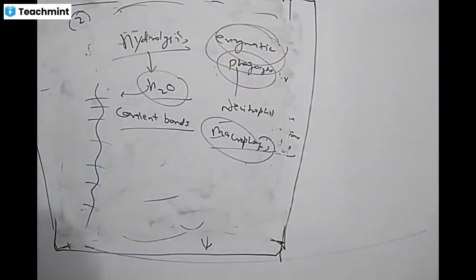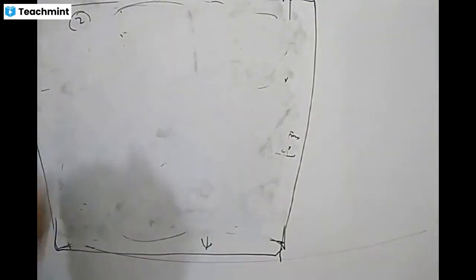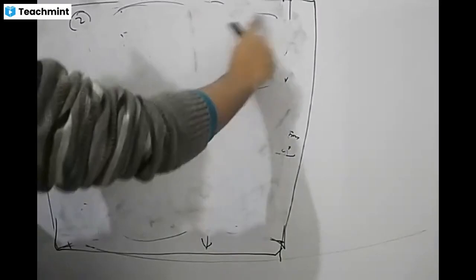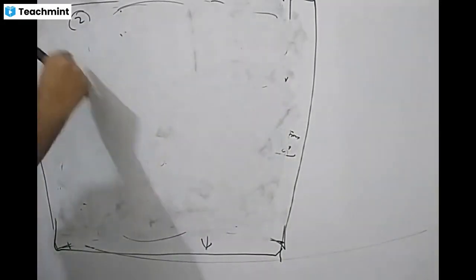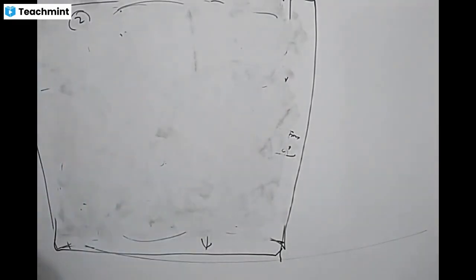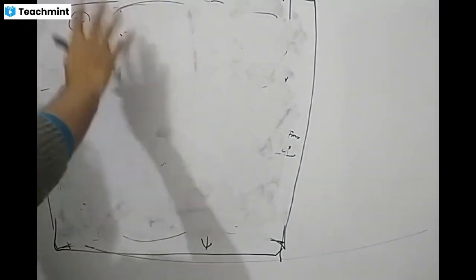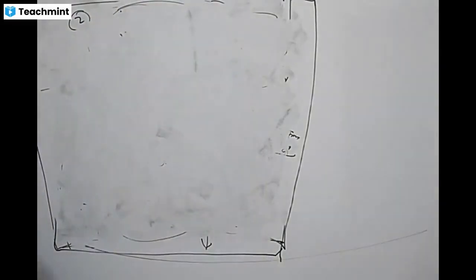So the second characteristic is absorbability. The suture material may be absorbable or non-absorbable. It depends on the place where we are using it. We use non-absorbable mostly for the skin and absorbable for the internal organs, that may be your peritoneum, muscles, subcutaneous tissues. Absorbable sutures are absorbed and broken down within 60 days, and non-absorbable ones take more than 60 days.